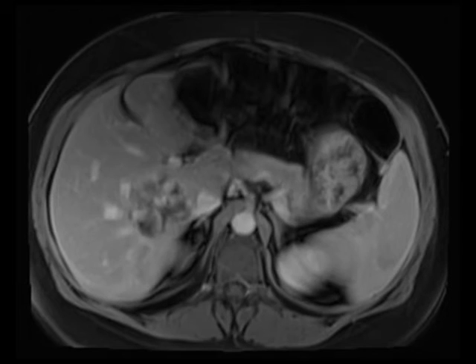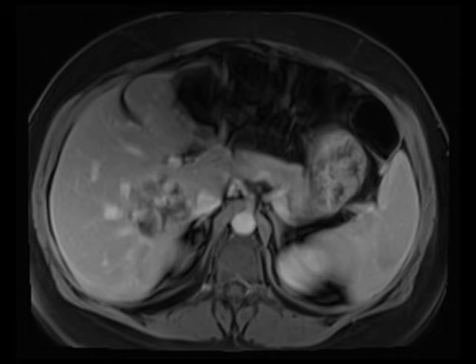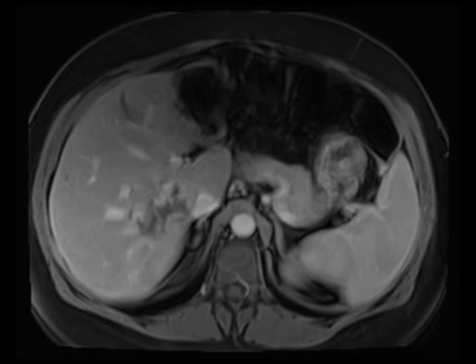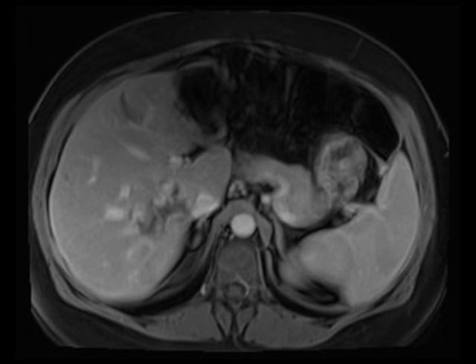Notice that you're dealing with a very T2 hyperintense mass — almost cystic in terms of its appearance. And on the post-gadolinium images, because of that soft tissue resolution of MR, you can nicely illustrate the classic globular, nodular, peripheral enhancement with centripetal fill-in. So this is a classic example of hemangioma.